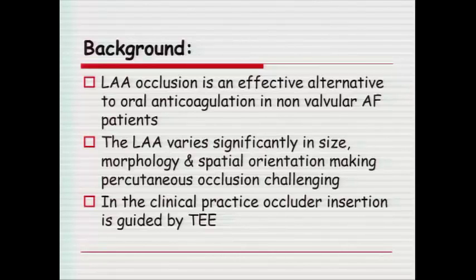Left atrial appendage occlusion is an effective alternative to oral anticoagulation in non-valvular AF patients. While the left atrial appendage varies significantly in size, morphology, and spatial orientation, which makes this especially challenging for percutaneous occlusion. In clinical practice, occluder insertion is guided by TEE.